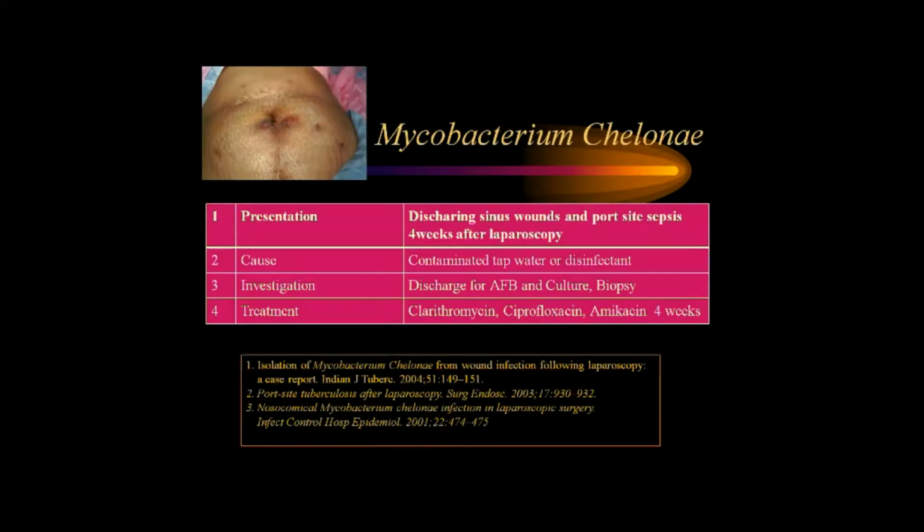Next slide. And a lot of concerns are raised, especially when we use chemical disinfection and our rinsing protocol is not good, and if the water is contaminated in the hospital, it can cause infection by Mycobacterium chelonae. The patients usually present with discharging sinus wounds and port site sepsis, usually around 3 to 4 weeks after laparoscopy. In such situations, one has to take the discharge for acid-fast bacilli and also do culture and biopsy.